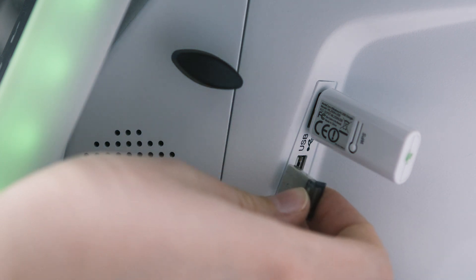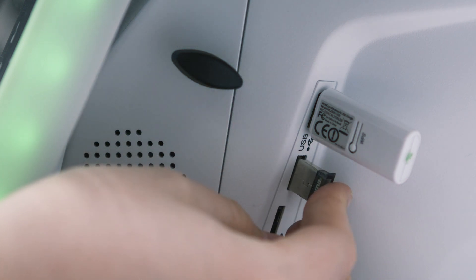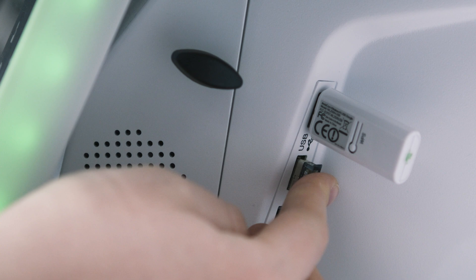Connect your Bluetooth stick to the furnace. Use the USB slot on the side to ensure an optimum connection.